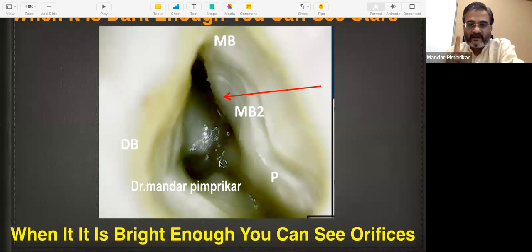Remember, we are now with the concept of crown down. What do I mean by crown down? You divide the tooth into 3 parts: the coronal 1/3, the middle 1/3, and the apical 1/3. If you are able to take care of the pulp tissue in the pulp chamber and the coronal aspect of the orifices, you have taken out 60 to 70% of the bacterial load or tissue load on the tooth without touching a file.